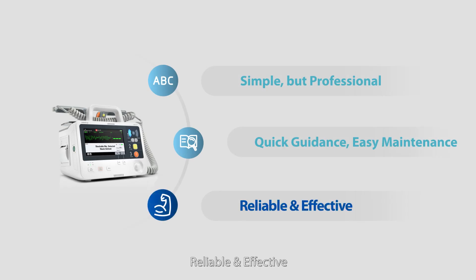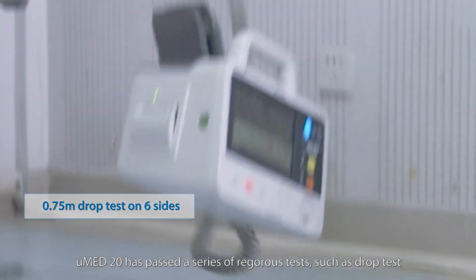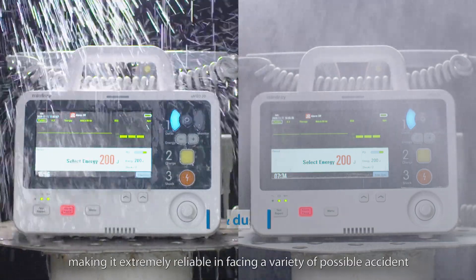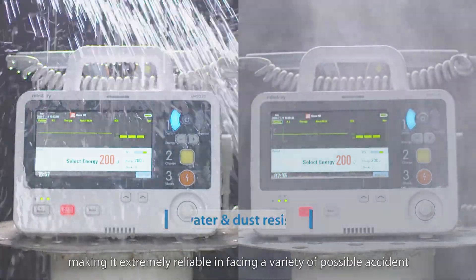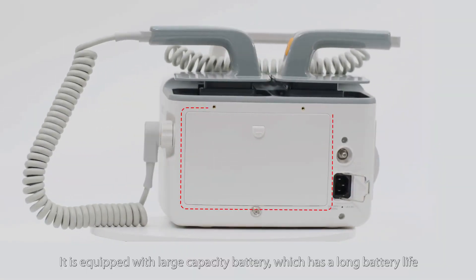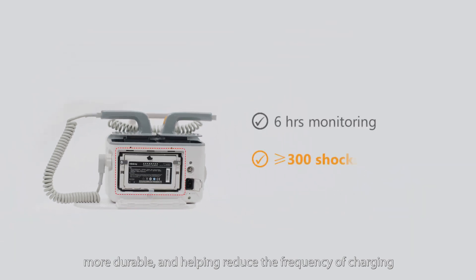Reliable and effective. U-Med 20 has passed a series of rigorous tests such as drop test, water and dust resistance test, making it extremely reliable in facing a variety of possible accidents. It is equipped with a large capacity battery, which has a long battery life, more durable, and helps reduce the frequency of charging.